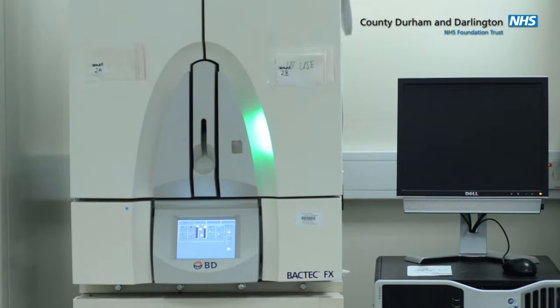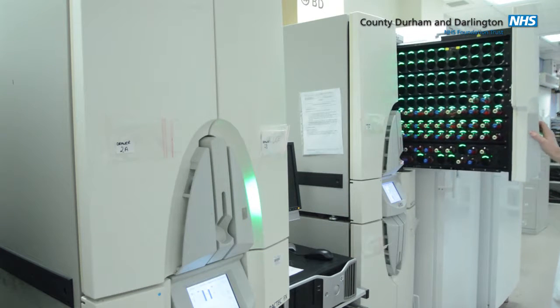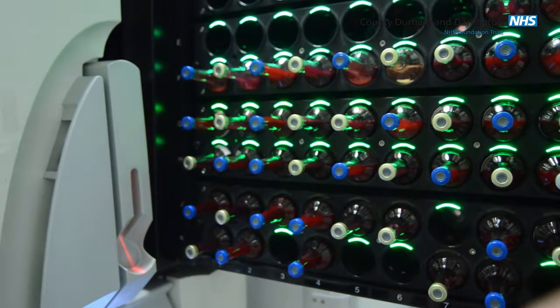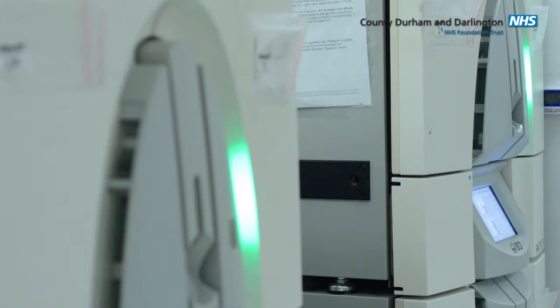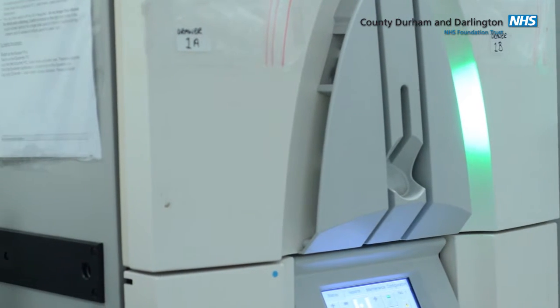The laboratory incubates all blood cultures for a minimum of 5 days. Culture for blood specimens is an automated process. Consultant microbiologists will communicate any positive results with the clinical team and advise appropriately. There is no need to telephone for negative blood culture results.